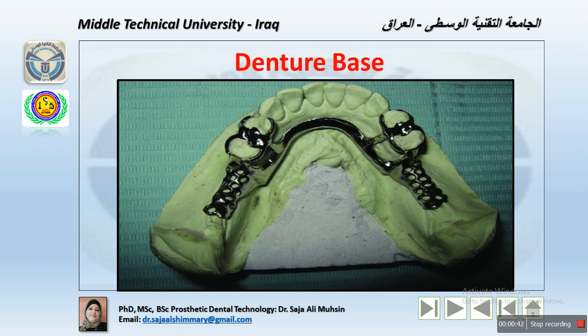The distal extension removable partial denture doesn't have the advantage of total tooth support because one or more bases are extension covering the residual ridge distal to the last abutment. It therefore is dependent on the residual ridge for a portion of its support.